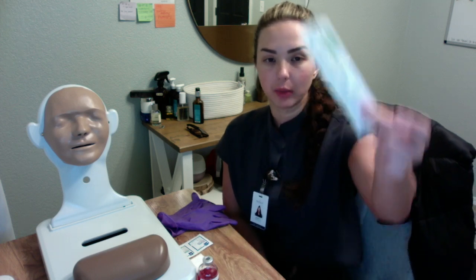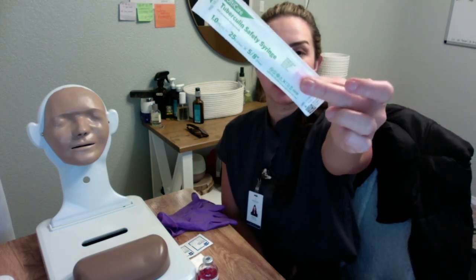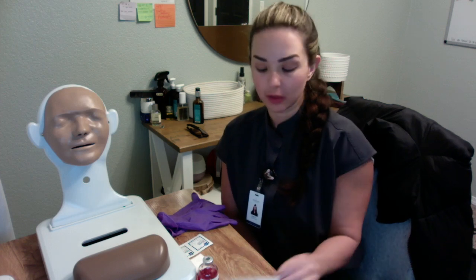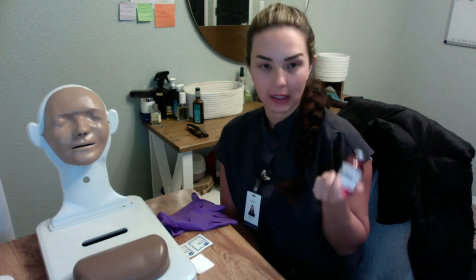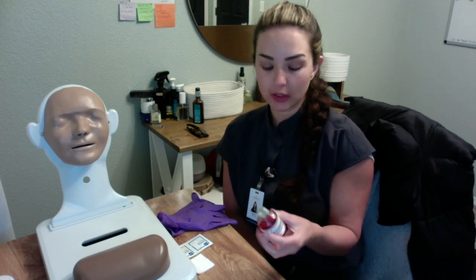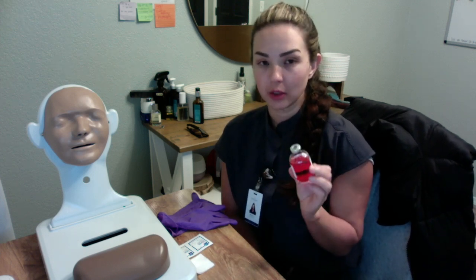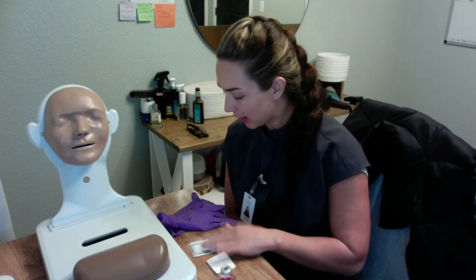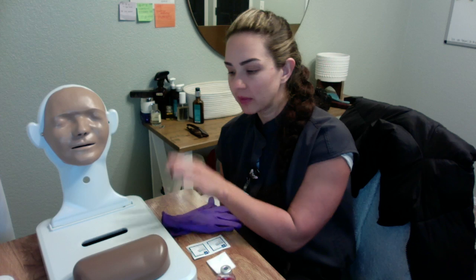So I will be using a syringe, ideally a 29 to 30 gauge half-inch needle with a 1 ml syringe. We have got our medication vial, which is going to be tuberculin purified protein, and the dose is going to be 0.1 ml per dose. We've got gauze pads, alcohol prep pad, and then we've got our gloves and then our patient.